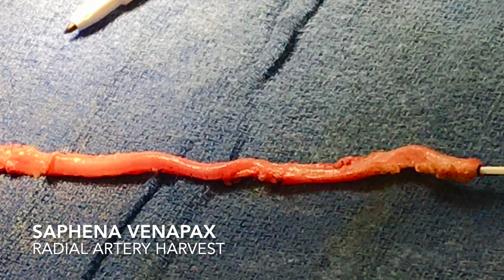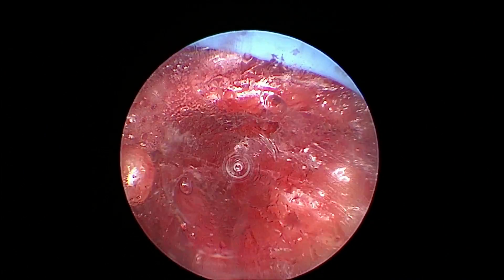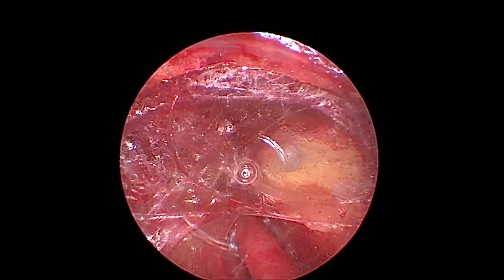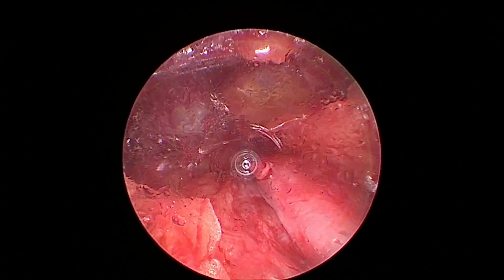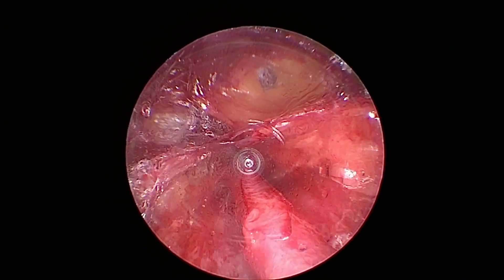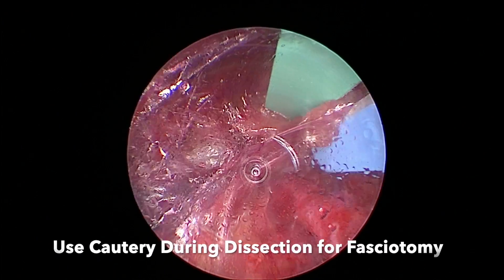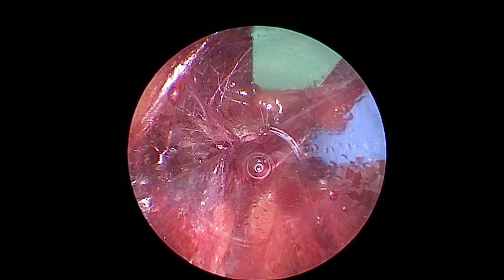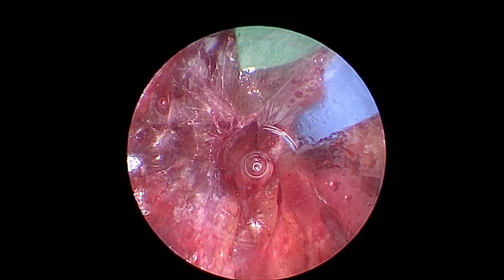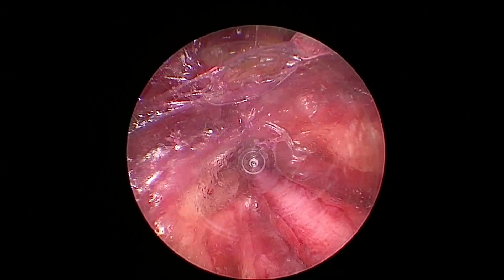This is an instructional video using the Safina Venapex system to do an endoscopic radial artery harvest. After making my incision and freeing up the radial artery, I've inserted my soft trocar. I really like the soft trocar that the Venapex has, particularly for the radial. I go in with the tip and start to do my fasciotomy, which I can do while I do my dissection — another thing I really like about the device.